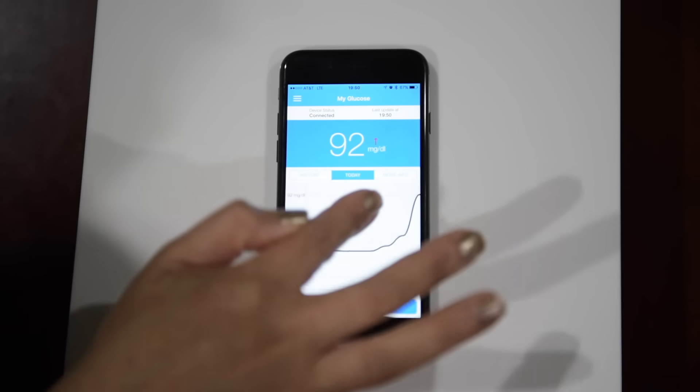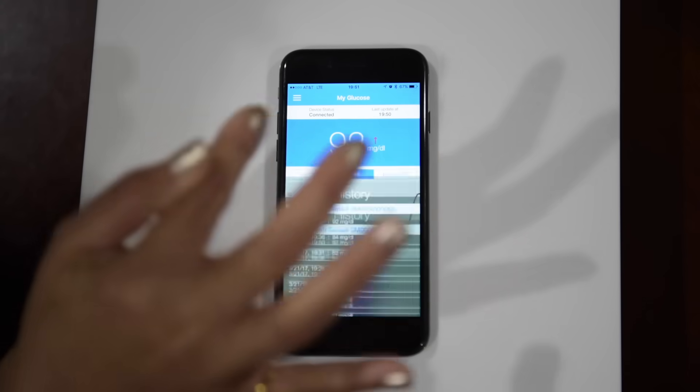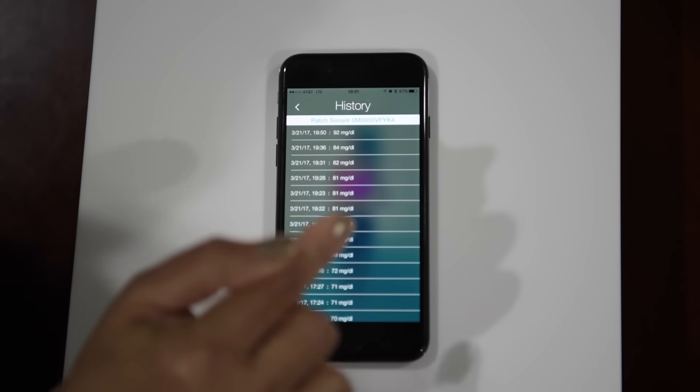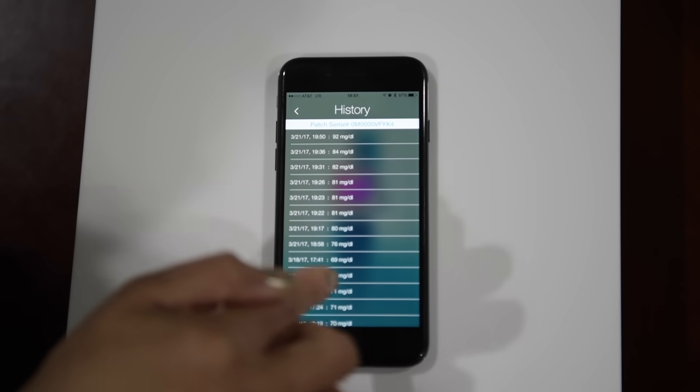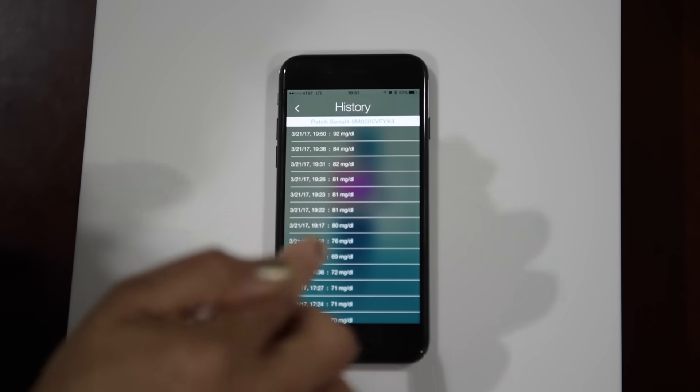Readings will be updated every five minutes. If you want to see the previous readings, tap on the history tab and it will show all the readings since the sensor was activated.